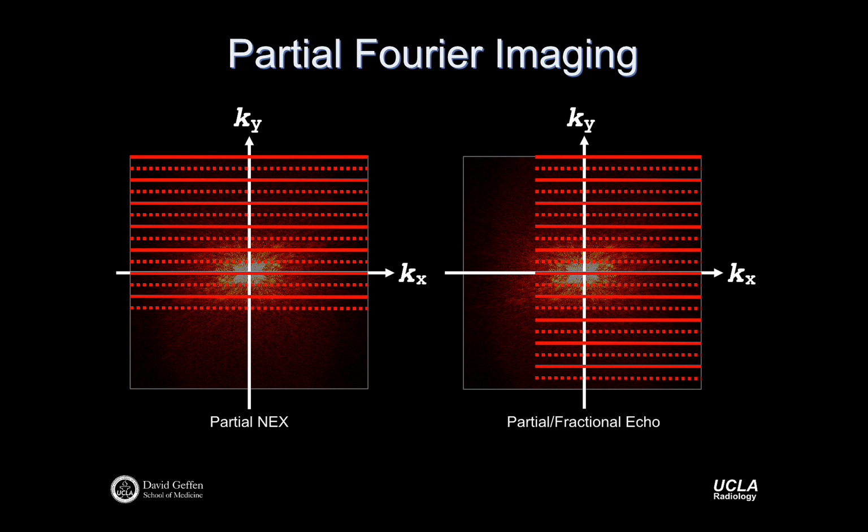So what impact does this have on scan time? Up or down? Down, right? We haven't acquired as many lines in k-space, so obviously we can scan faster. That also has a consequence on our signal to noise. For this kind of acquisition, is our signal to noise up or down relative to full k-space? Down, right? What about our voxel size? Have we changed our voxel size or our pixel size by not acquiring these lines down here?